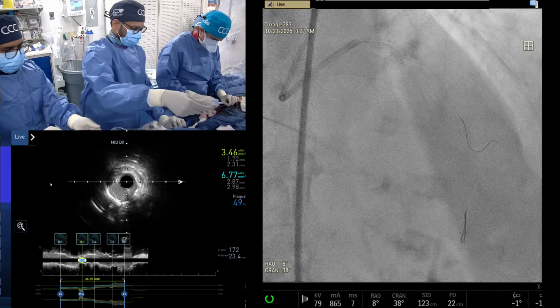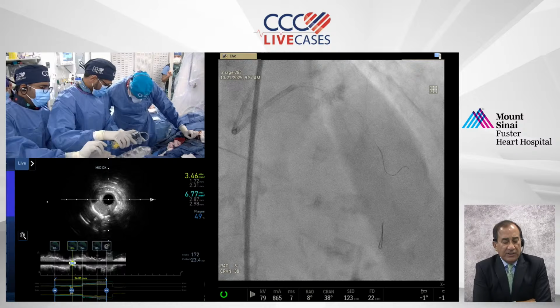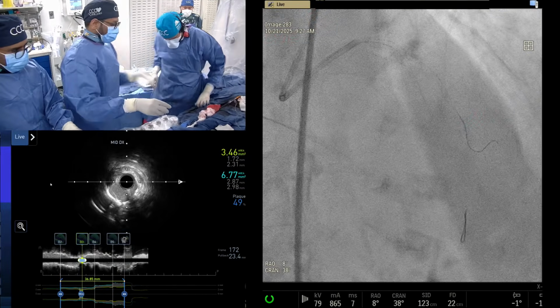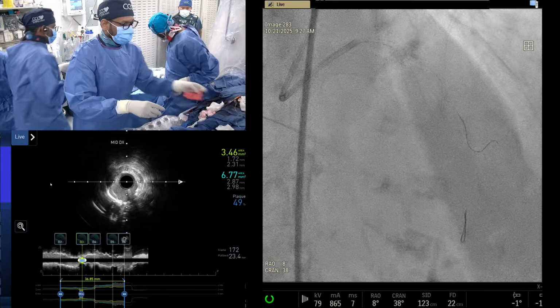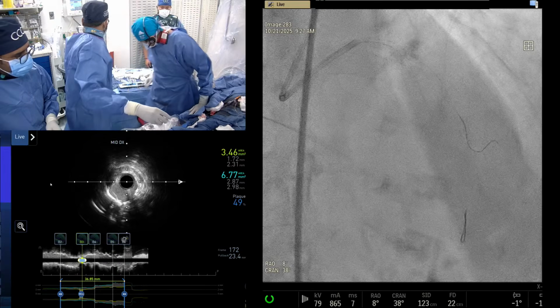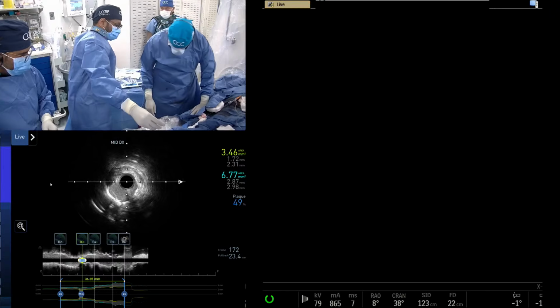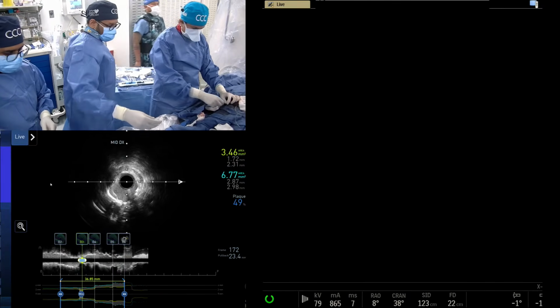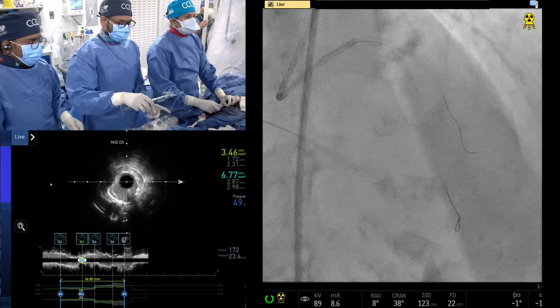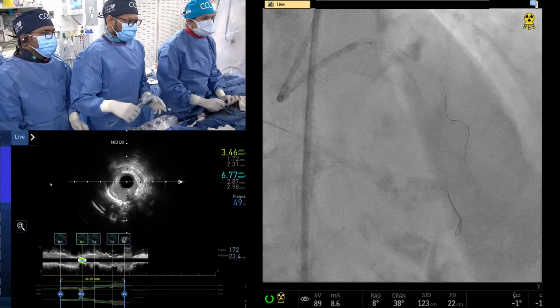How would it clinically correlate? Do you discharge the patient? Yeah, that was the question. They did a second value between 1 and 3 hours. That was the institutional protocol, so every patient had those CKMB. Just like us, we have one at baseline and between 4 to 6 hours, and patients are admitted because the MBs were elevated. For other inpatients, we do another one between 16 to 24 hours. So the question comes down to when do you measure it? Every patient had it.